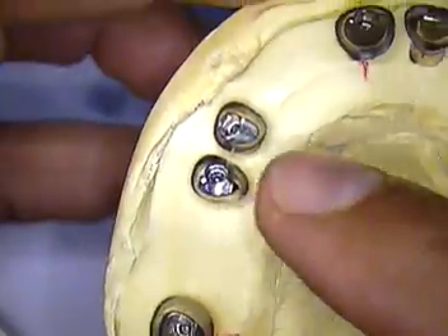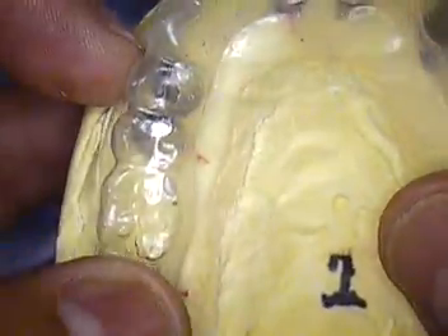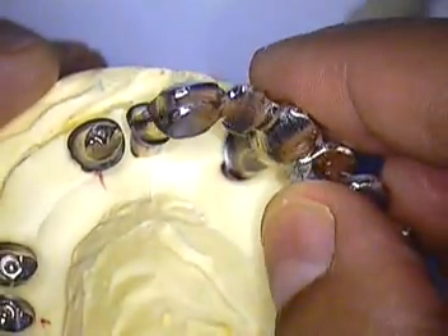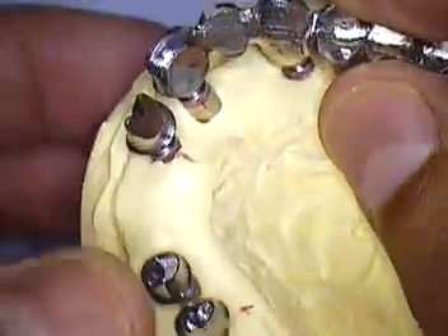Also this abutment here was taller and this one was shorter. With that being said, we had a visual of before when we made the outer copy — an OmniVac placed on the model. The laboratory then waxed up the framework, using not only that OmniVac but also a silicone index. And this is one of the frameworks that's fitting.